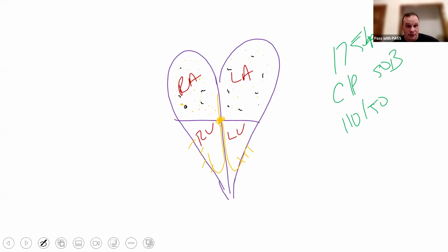So my concern, Brandon Schoberg's concern, is when I apply the ACLS treatment to this and I put pads on this patient and I synchronize cardiovert them at my 120 to 200 joules and I get them out of AFib and all of a sudden I get them back into a sinus tach or a normal sinus rhythm, what's going to happen now that my atria, boom, start squeezing again, right? And they start contracting and filling and contracting and filling.